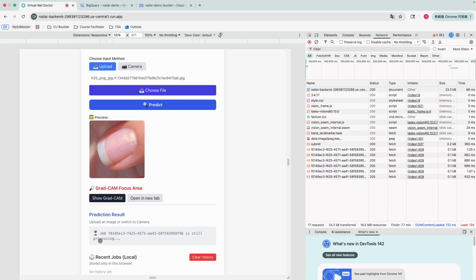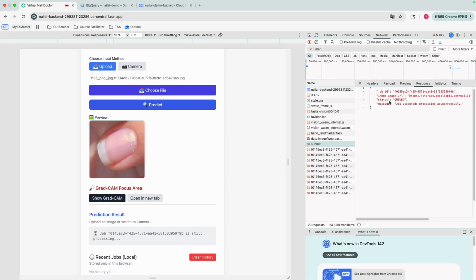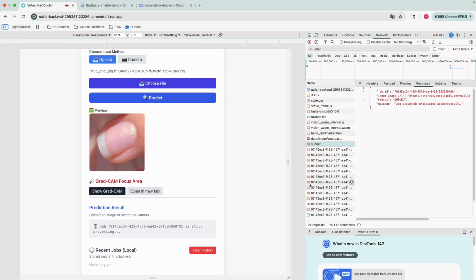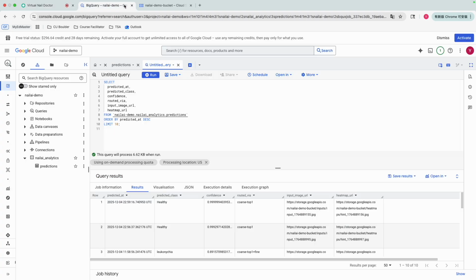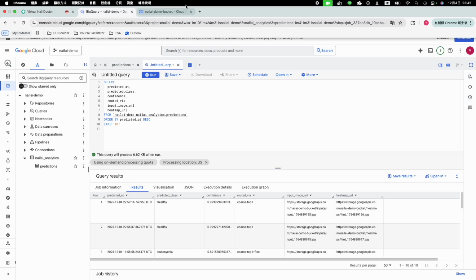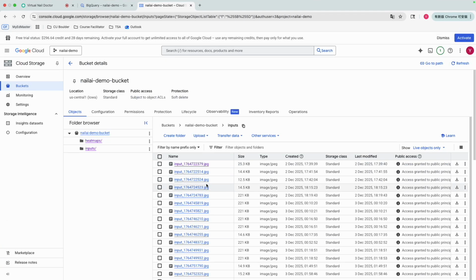So we can see the job is still processing, and we can see here the submit response, the status is queued, and this response will be written into BigQuery. Okay, and while we wait for the result, we can see the BigQuery here and the nail bucket. In the bucket, I store the heat map images and the input images.